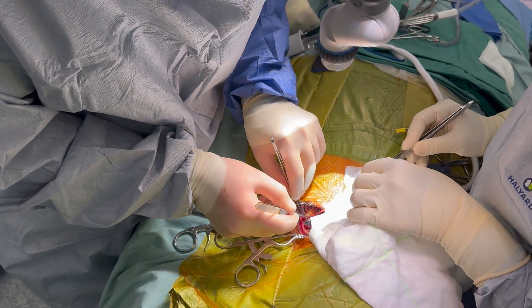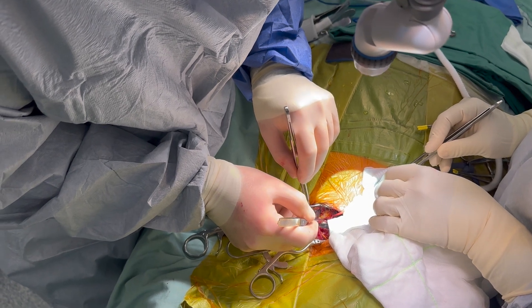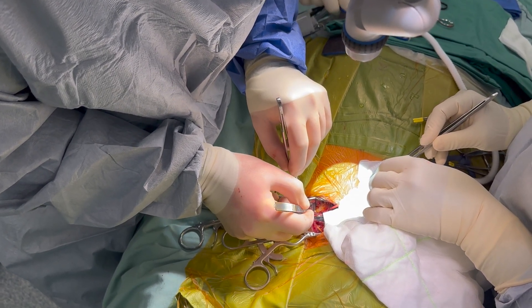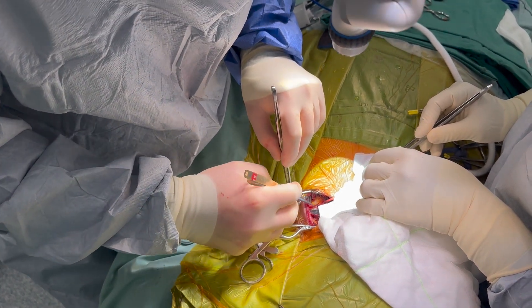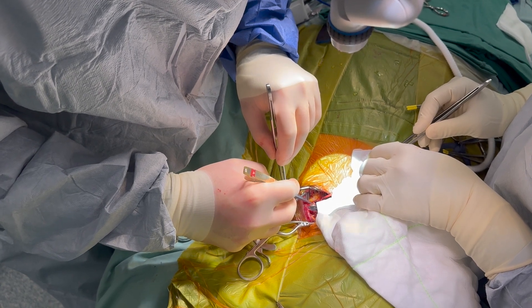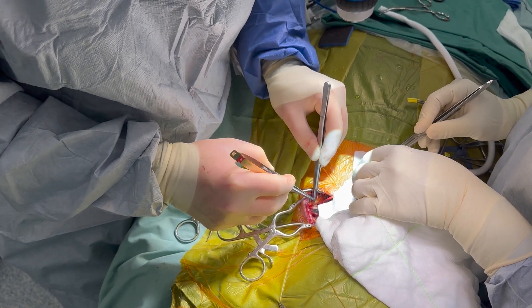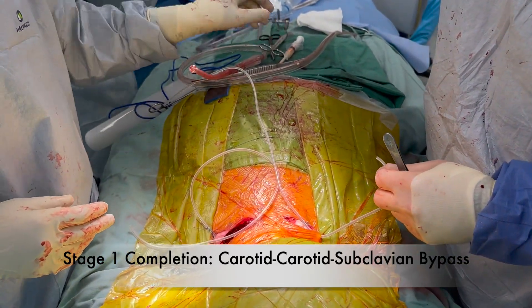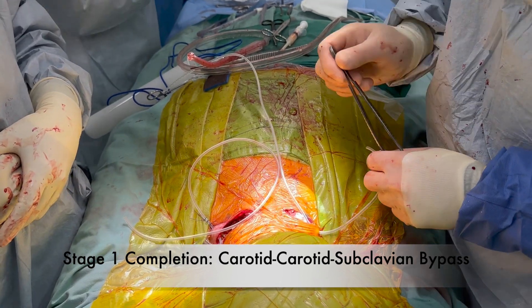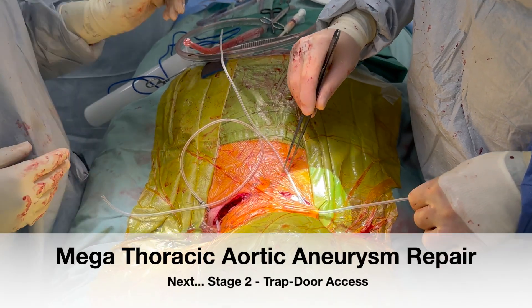The artery is very soft and very friable — the intima is coming away very easily from the underlying layers. Right after finishing the bypass, the procedure has gone very well and as planned.